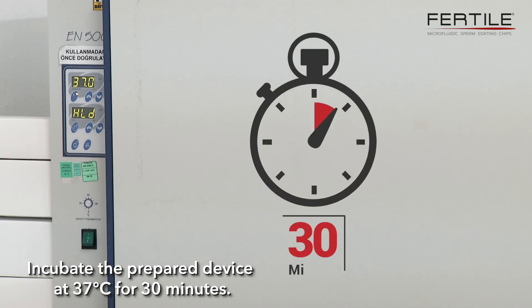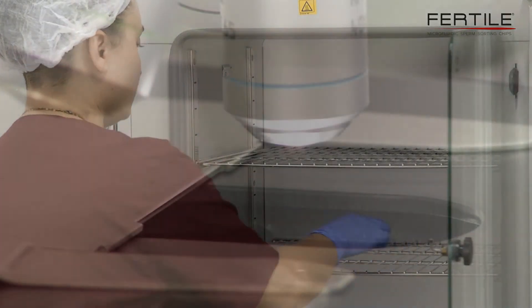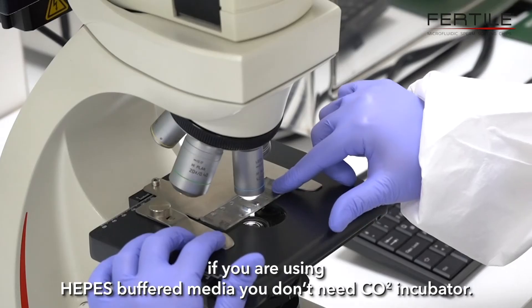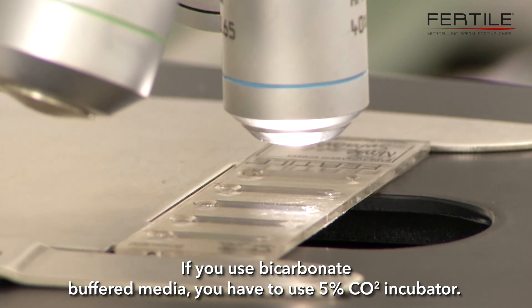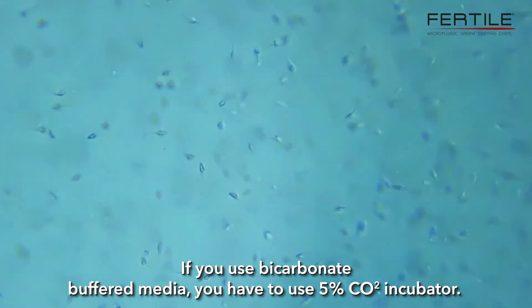Incubate the prepared device at 37 degrees Celsius for 30 minutes. If you are using HEPES buffered media, you don't need a CO2 incubator. If you use bicarbonate buffered media, you have to use a 5% CO2 incubator.